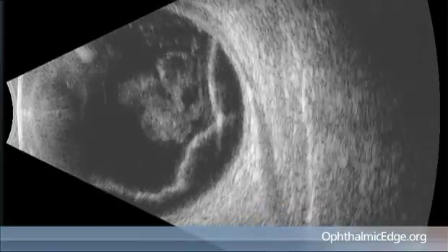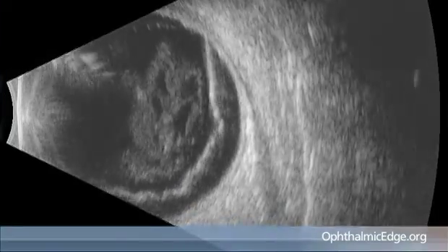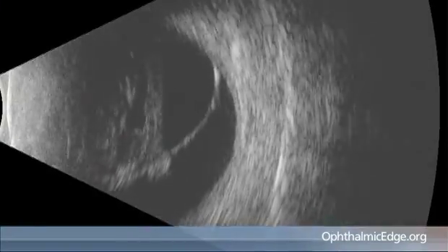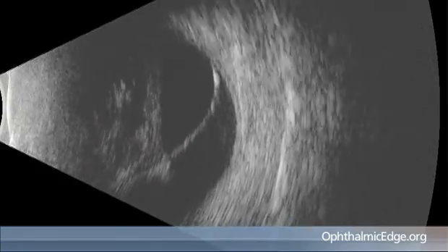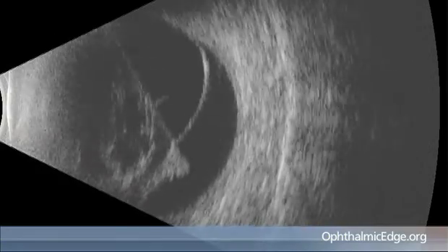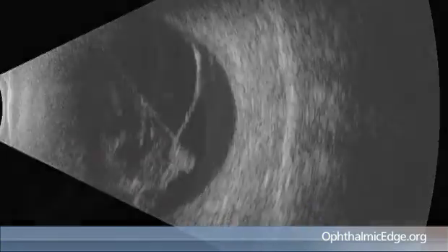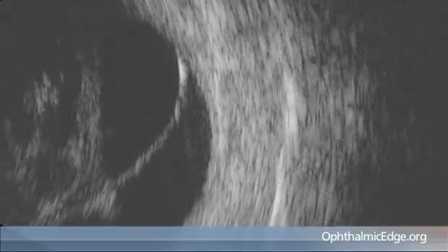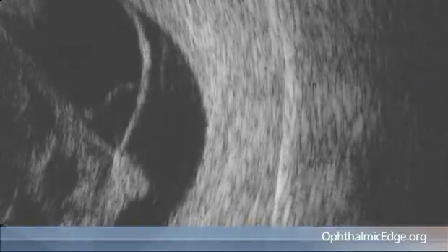Is it blood just within the formed vitreous, or is it blood behind the vitreous face? All these movements and motions — even subretinal fibrillar material in a long-standing detachment — have movements which are pretty diagnostic, and you're going to see many of them in the library that follows these basic lessons. So real time is an important part of clinical diagnosis.